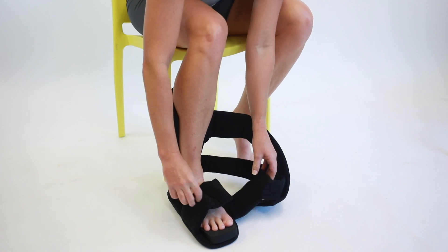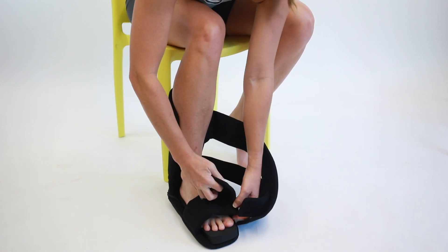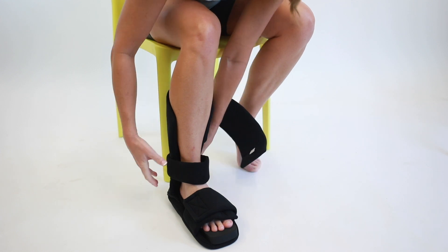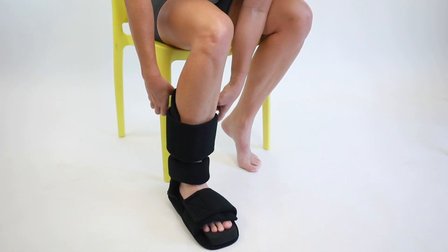Place your heel firmly in the back of the splint and fasten the toe straps. Fasten the ankle strap and fasten the calf strap.